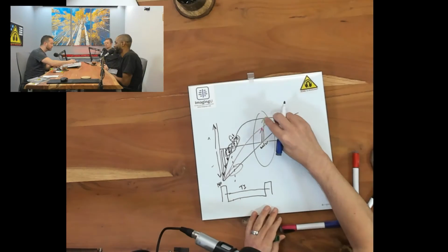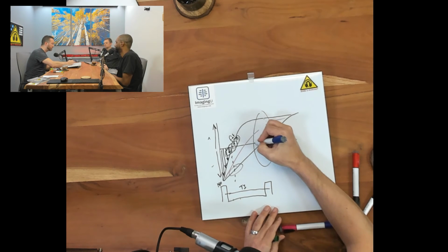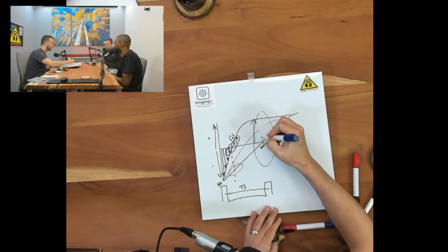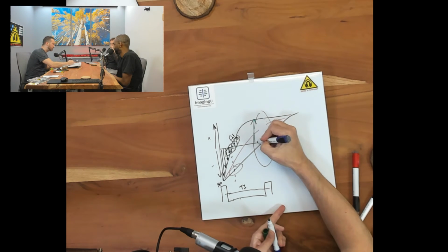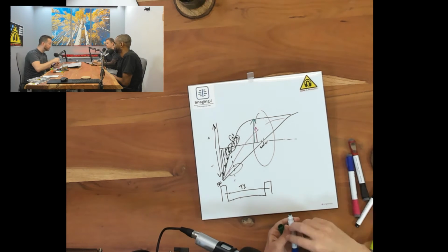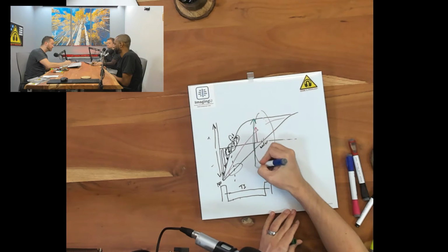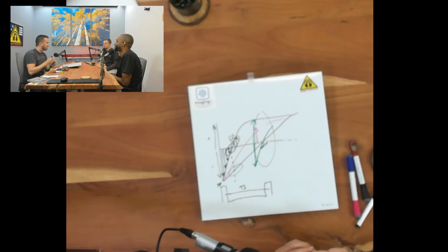So with a triple IR, at this point I've got full fat, and myocardium's definitely playing the game a decent amount, just inside the slice. And so then we reinvert the fat, and then it crosses the null point at the exact same time as water, and so you have dark blood, you have dark fat. That's how that works. It's pretty clever.